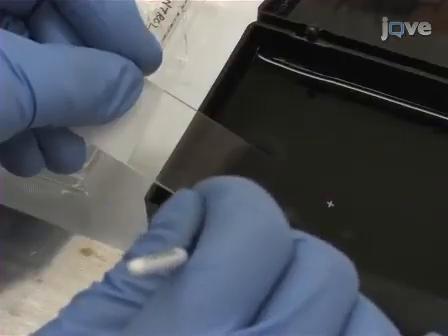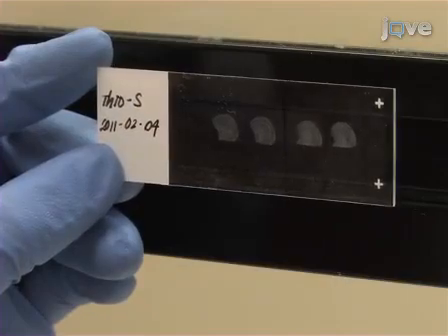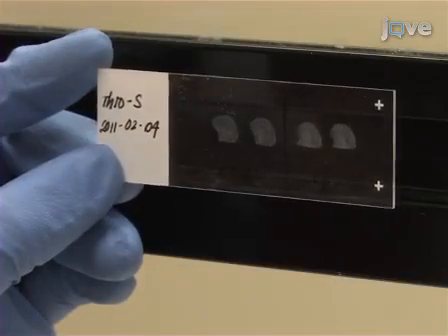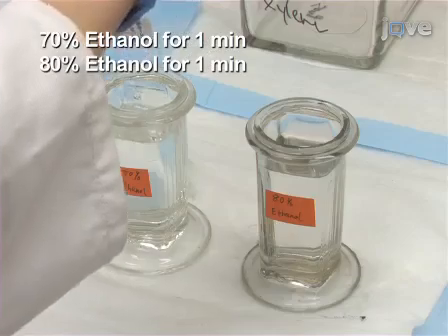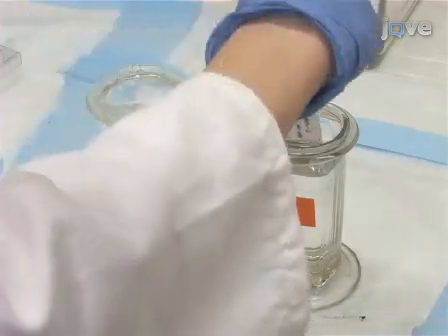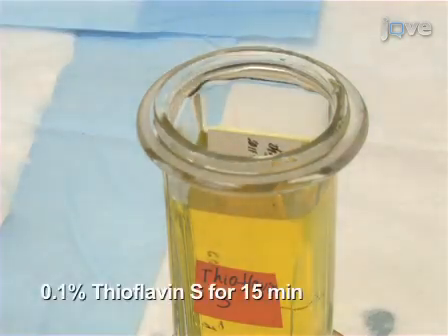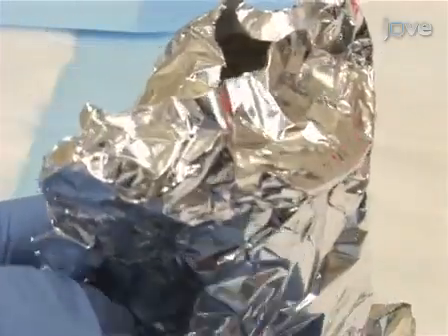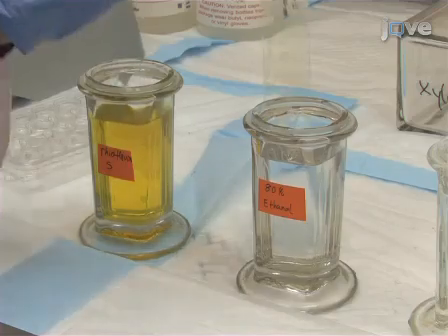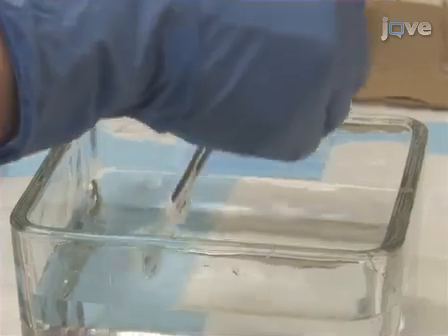Extract brain tissue from mice as shown earlier. Mount 4 to 5 hemibrain sections onto a glass slide and air dry completely. Dehydrate samples in 70% ethanol for 1 minute, followed by 80% ethanol for 1 minute. Next, incubate slides in 0.1% filtered thioflavin S solution for 15 minutes, taking care to protect the thioflavin S solution and stained slides from light. Wash slides with 80% ethanol for 1 minute, 70% ethanol for 1 minute, and distilled water twice.